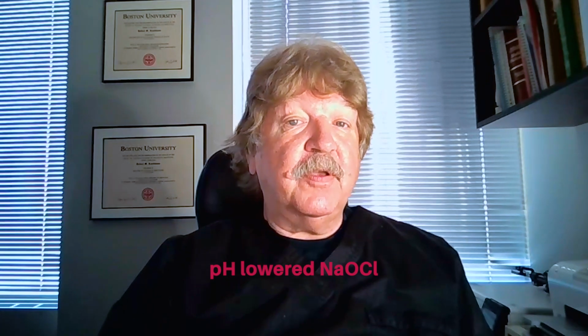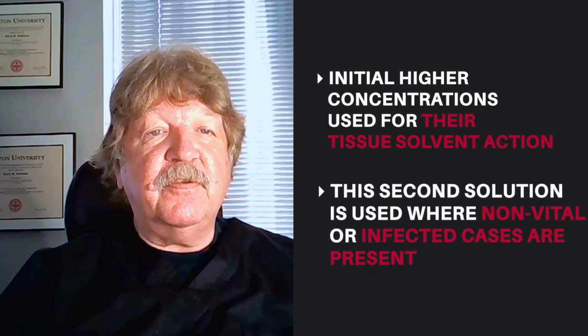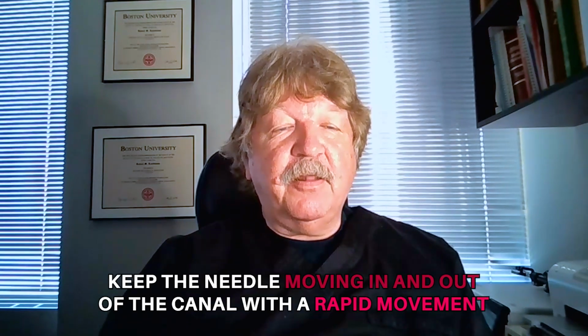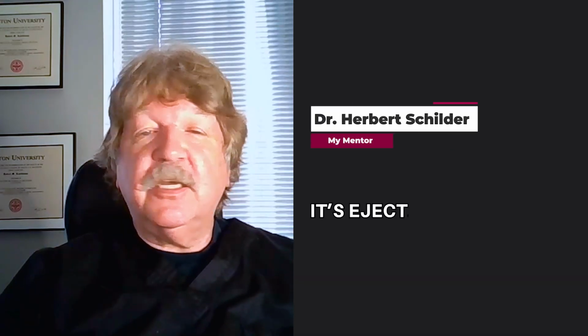In clinical practice, I continue to use my standard irrigation protocol, but I use this pH-lowered sodium hypochlorite version as a final antibacterial rinse. The initial higher concentrations are used for their tissue solvent action, and the second solution is used when non-vital or infected cases are present. Whenever irrigating solutions are used, the most important thing to remember is to keep the needle moving in and out of the canal with a rapid movement. Never lock it in the canal or insert it without this. As my mentor, Dr. Schilder, used to say, it's eject, not inject.